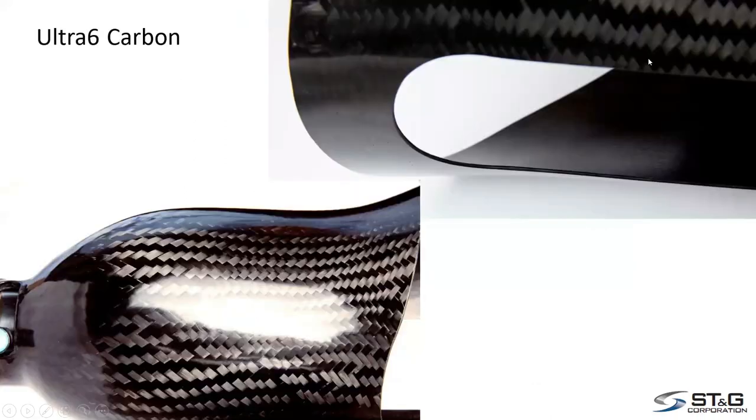And one of the nice things is you can see how thin the lamination comes out. Now, the picture on the bottom left, you can see how nice and filled in that braid looks. And it's kind of a glossy finish, and that's with an epoxy. If you use an acrylic, you're going to see more braid definition on the surface because epoxy is a little thicker and it likes to fill in a little nicer. The acrylic is more watery, and when it hardens, it tends to thin down more, and you'll get more of a rough surface of that texture of the carbon fiber.